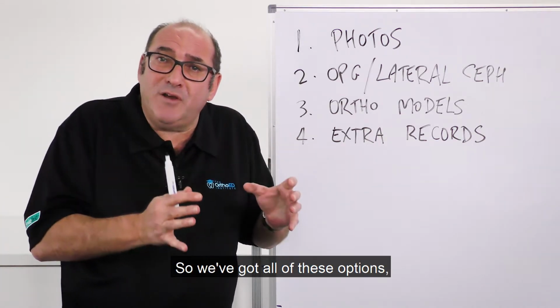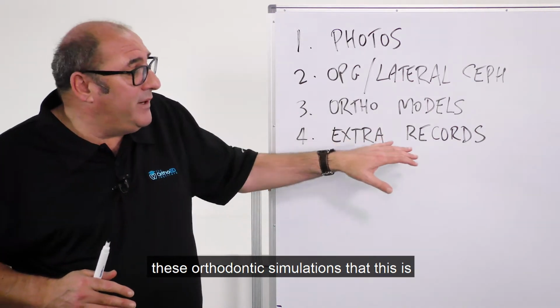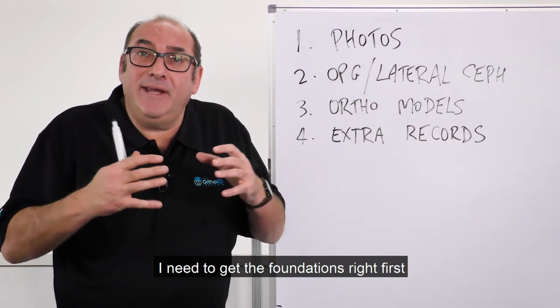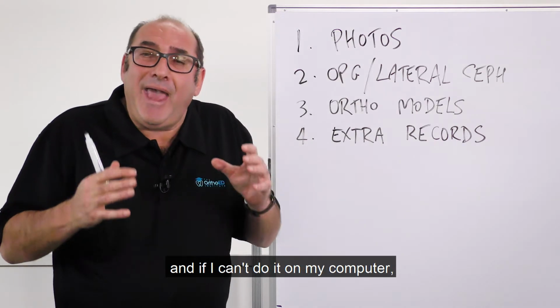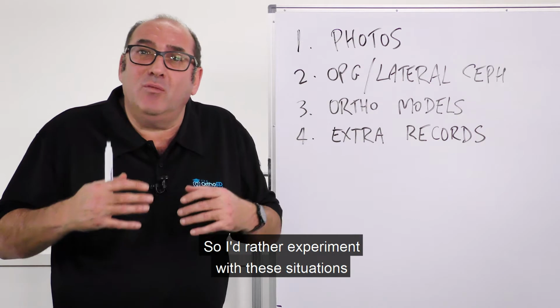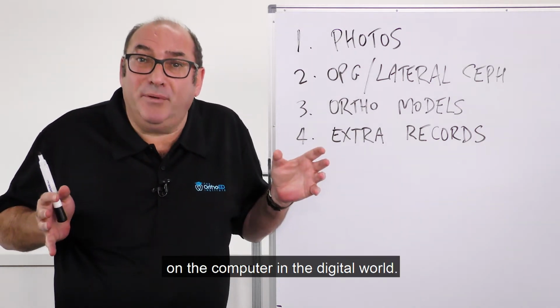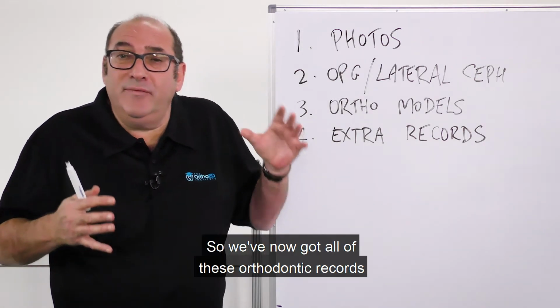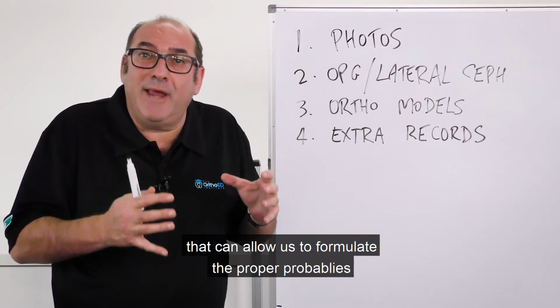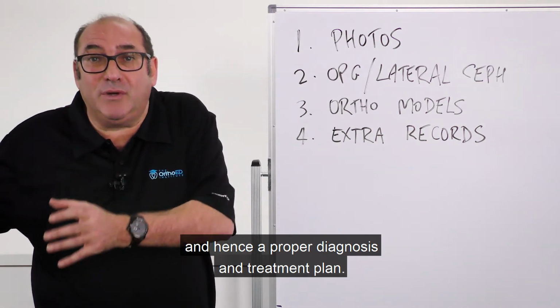So we've got all of these options. And I explain to the patients when we need to do these orthodontic simulations that this is like building a house. I need to get the foundations right first. And if I can't do it on my computer, I can't do it in your mouth. So I'd rather experiment with these situations on the computer in the digital world. So we've now got all of these orthodontic records that can allow us to formulate the proper problem list and hence a proper diagnosis and treatment plan.